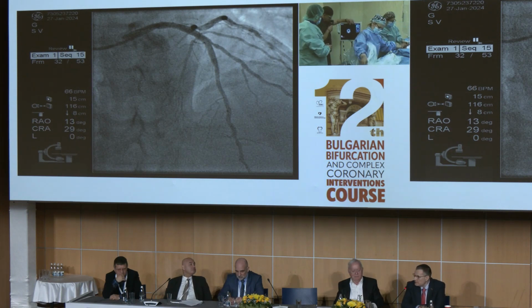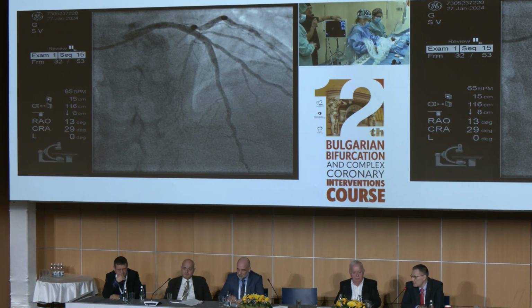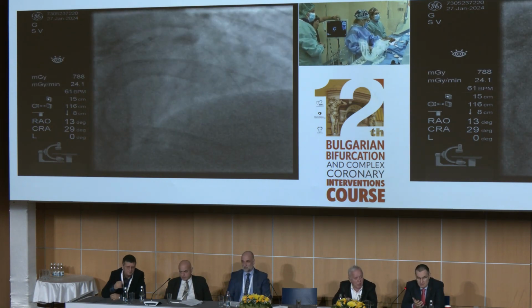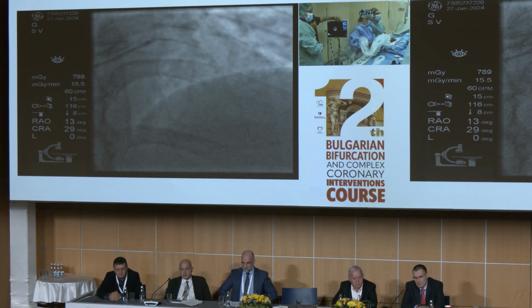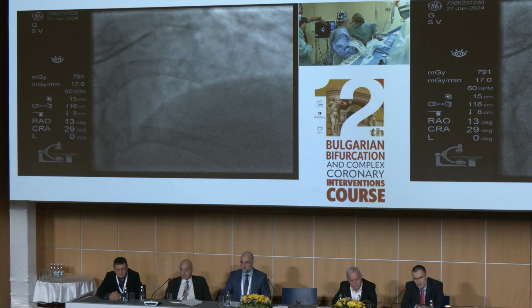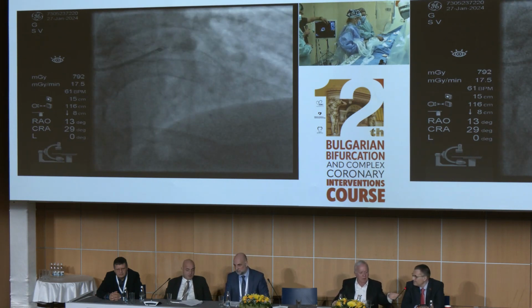But anyway, my suggestion is not to manipulate anymore at the bifurcation. The minimum stented area is around 6 to 7 distally, I think, with a post-stent. The other stent point is excellently apposed, totally following the anatomy of the bifurcation. Just don't touch anymore.